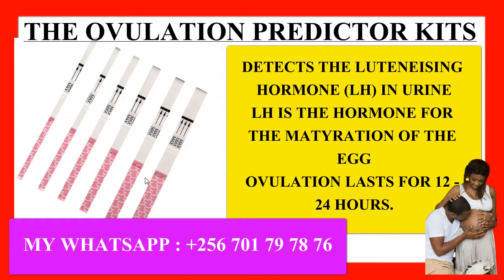But to understand how the predictor kits really give the results, you need to be very careful. You need to have a flat surface. You could actually get a whiteboard or a white paper, and then you put them on. If you begin putting them on day 1, day 2, day 3, specifically when you are most likely to go into your ovulation period, that is normally 14 days from the first day when you saw your period.